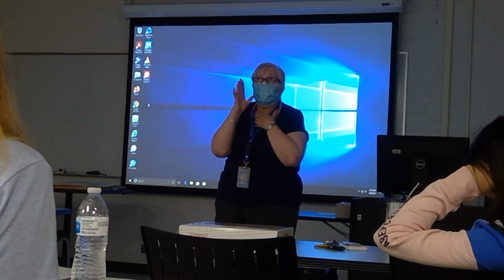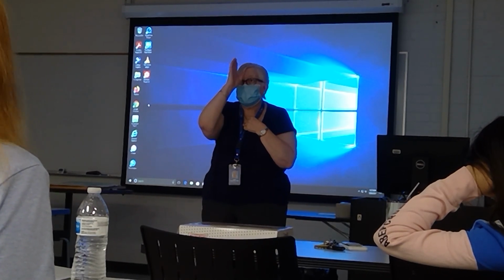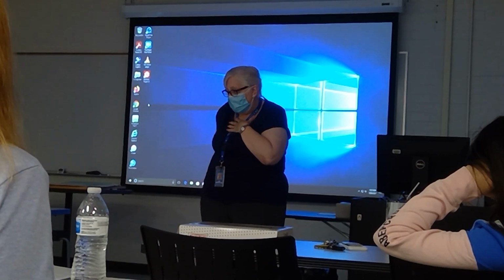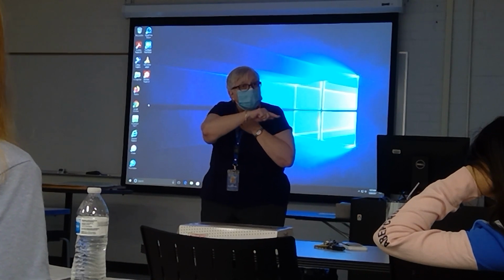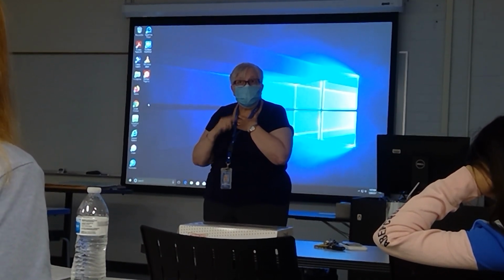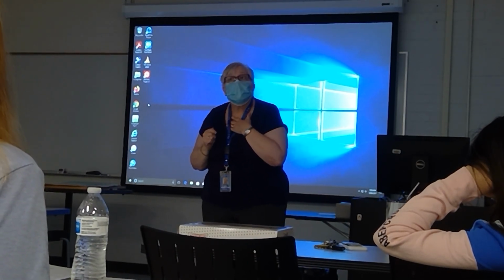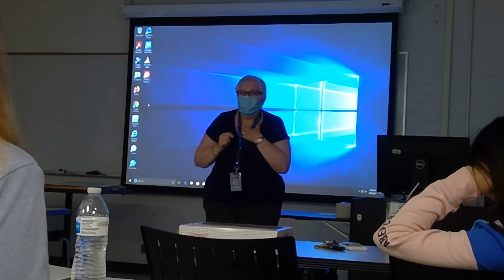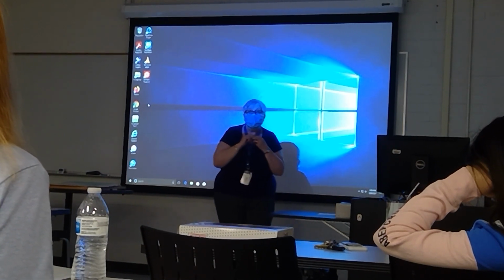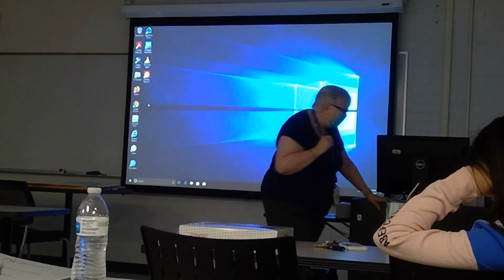Does the machine stay in one place? Or does it sit here and then move to here and then move to here and then move to here? Or does it do a rotation? What's the rotation called? VMAT. And I know you're going to hate me for this, but what does VMAT stand for? Volumetric modulated arc therapy. Yes. Remember that.